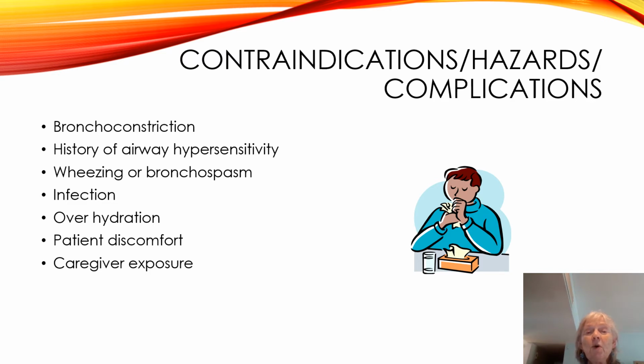Something else we need to watch for, wheezing or bronchospasm again, infection. Remember, anything that carries water with it carries the risk of infection. And if you remember, the number one germ that we have to watch out for is Pseudomonas at this particular point.